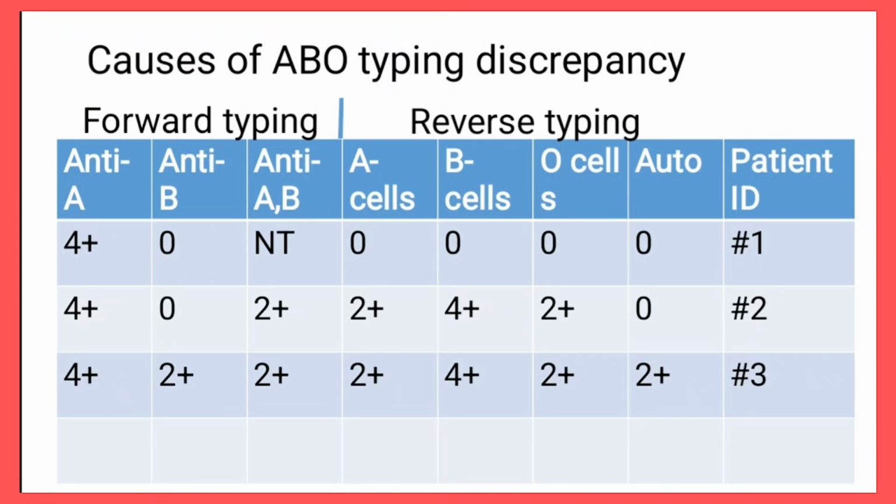However, even though the A cells and O cells show a weak positive, that shouldn't be there in the first place. Remember that A cells can only be positive if the person is blood group B, because blood group B has antigen B and antibody A, and that antibody A is what is supposed to react here. But on this occasion the person is blood group A, which means it has antigen A and antibody B. So this reaction on the A cells and this reaction on the O cells becomes something for us to ask a question about. Why should that be the case?